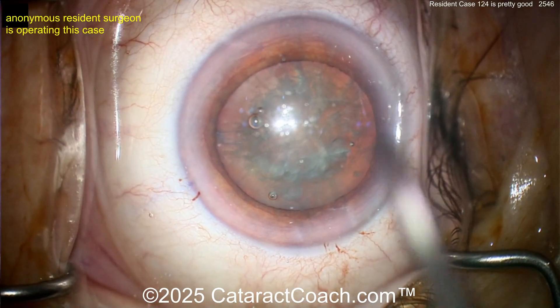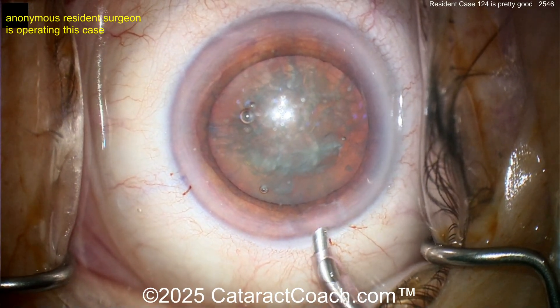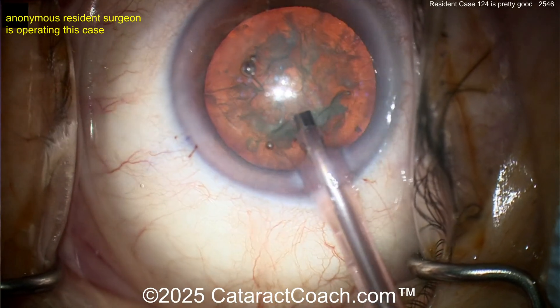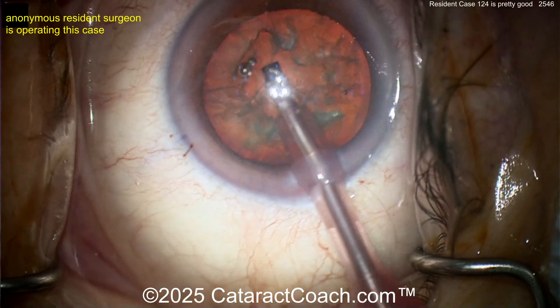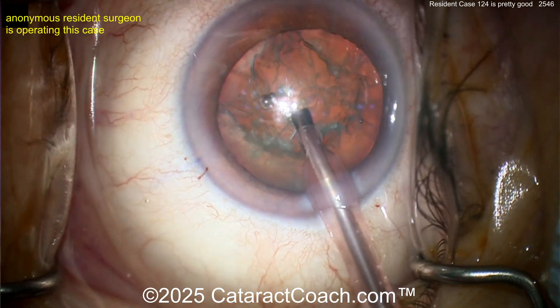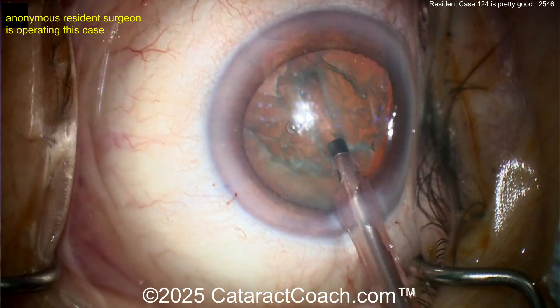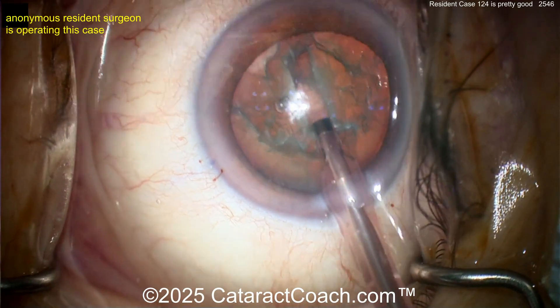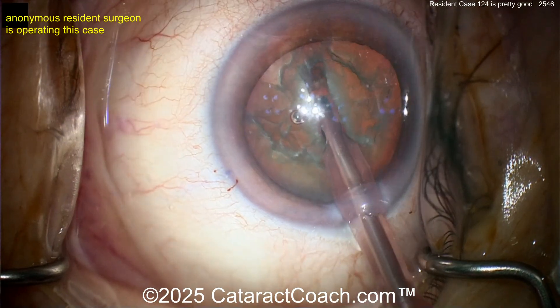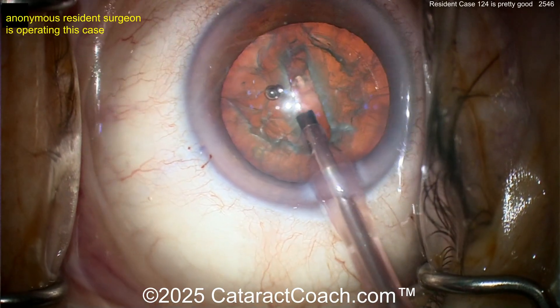If it spins, it makes your life a lot easier when you manipulate the nucleus within the bag. Here comes the phaco probe — got that pink sleeve on, so probably a 2.4 mm incision. I like to go inside the eye at position one. Also, I like to use the infusion to squirt the cornea before entering, because the cornea can get a little dried out. Now with the groove down the middle — probably stop-and-chop or divide-and-conquer. For this part you don't need a lot of vacuum, probably less than 100 mmHg, but you do need reasonable phaco power. That's a good-looking groove.